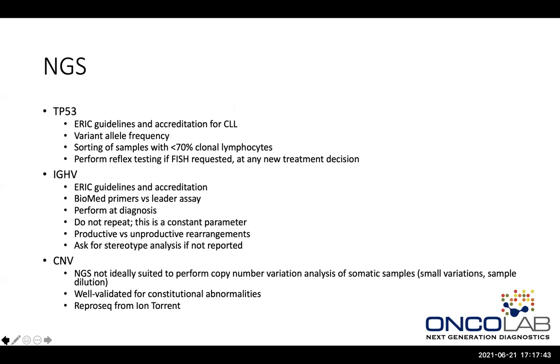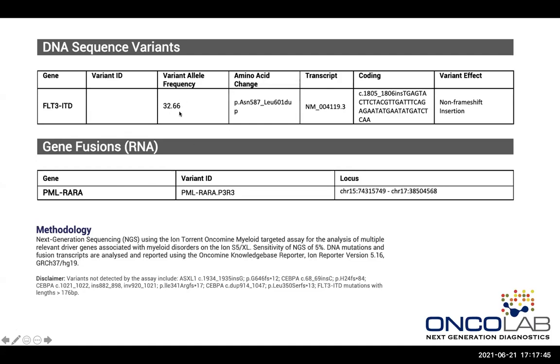Sorry, I need to go back and just answer Karen's question here about the allelic ratio of FLT3, which is very important. We kind of use the variant allele frequency of FLT3 as a surrogate marker, but it is not comparable and it is not as stable as an allelic ratio that is detected by Sanger sequencing or capillary electrophoresis. And there have been a couple of publications and people get very upset with one another who want to use this variant allele frequency, but it probably does not give you the same information that one wanted.